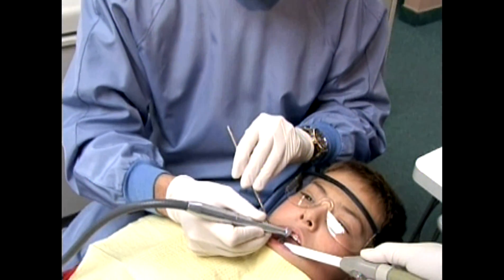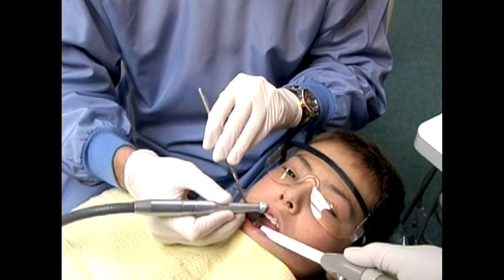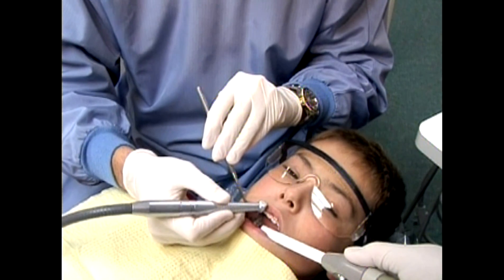Unlike the high-speed drill, Waterlase MD laser prepared surfaces are free of necrotic and infected smear layer and retain the natural microstructures of the teeth. Because there is no vibration and detrimental heating, the laser cavity preparations require minimal to no anesthesia.